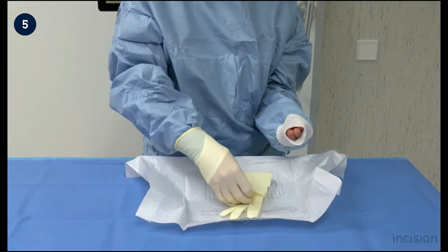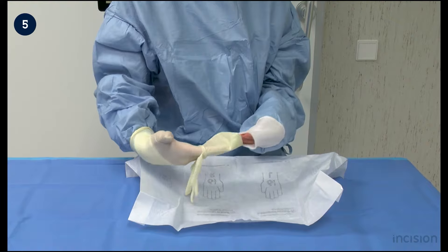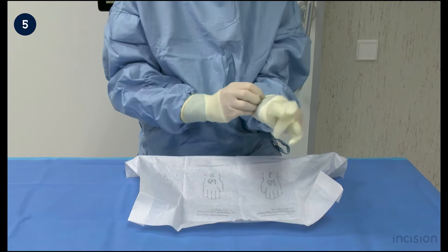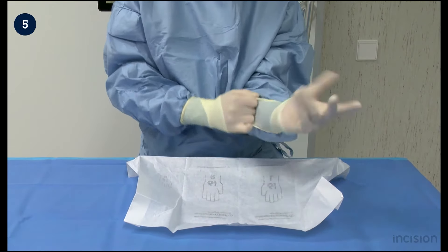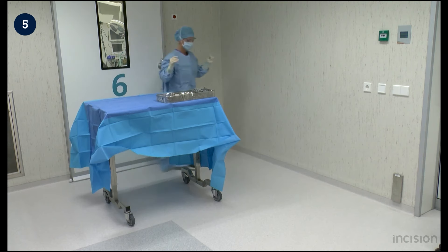Pick up the left glove with the right sterile gloved hand. The right gloved hand is placed inside the folded border of the left glove. The left hand is placed inside the glove. Pull the edge of the left glove to proximal and maneuver the hand and fingers into the glove. It is helpful to pull the glove covering the fingers to distal to create space for the fingers to get in the right position.